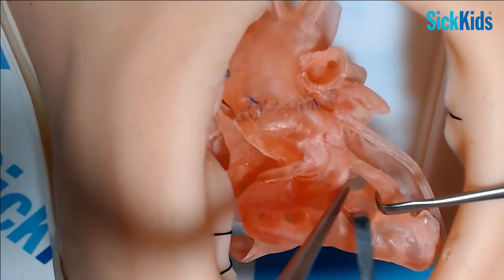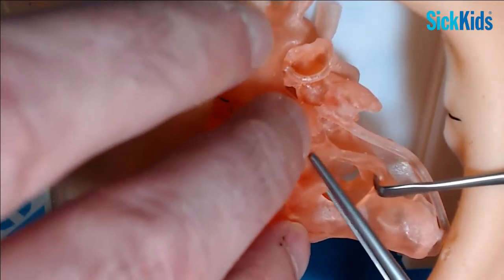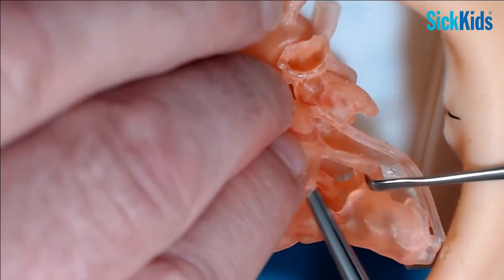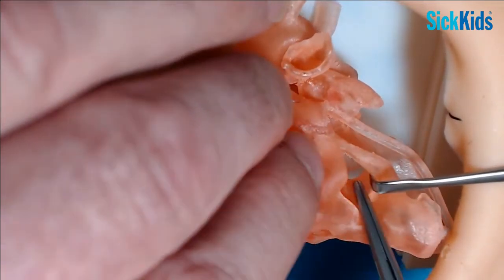Yeah, so around the margin of the VSD and then up around the margins of the truncal valve itself, and you can come up onto the free edge of the ventriculotomy. So you can see it's not going to be a circular patch, it's going to be more of an oval, elongated patch to accommodate everything there.